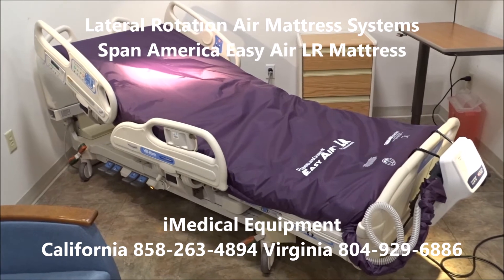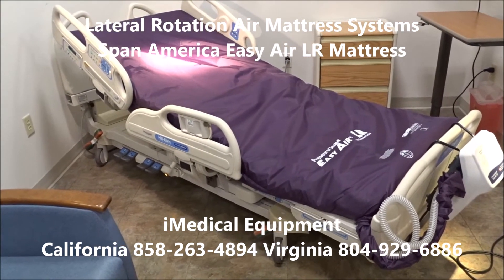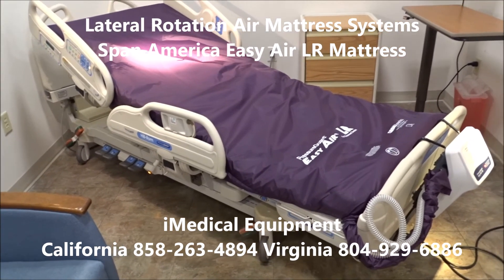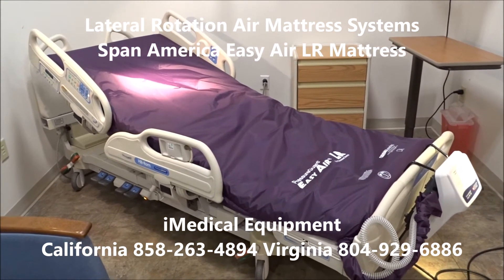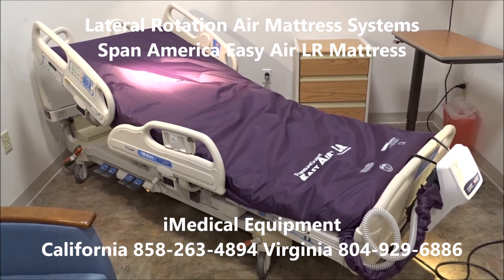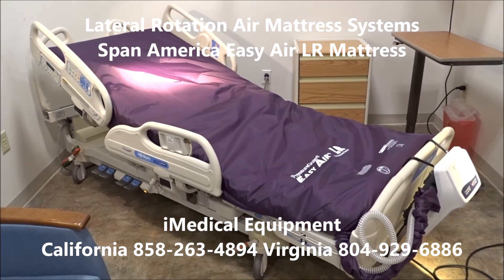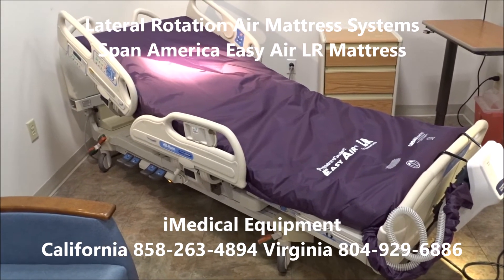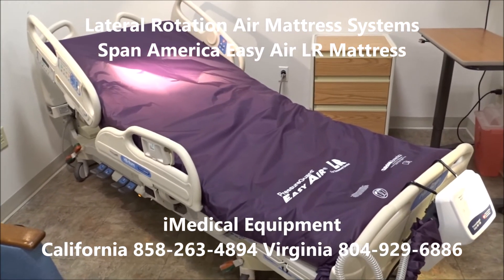The brand new SpanAmerica mattress system comes with a two-year warranty. The SpanAmerica air mattress system has lateral rotation, and it's a foam and air mattress system combined, so you have the qualities of very high-grade foam. The cuts of the foam are set up for pressure redistribution, and you've got the baffles which help turn the person. It also has low air loss, which puts cool air out and dissipates any moisture from the patient, giving them a better surface to sleep on and preventing sweating.